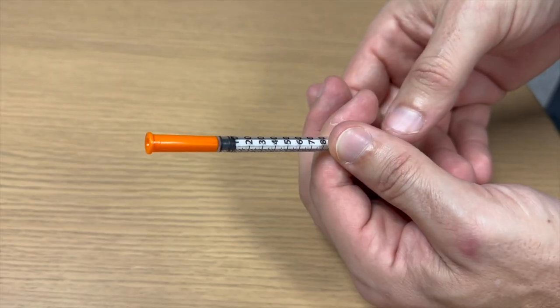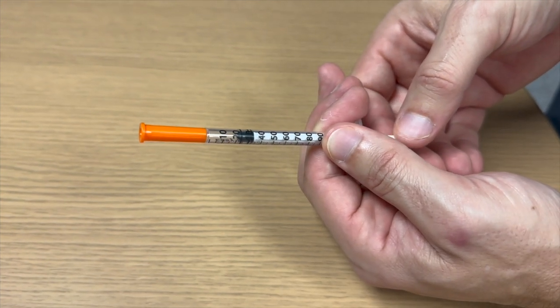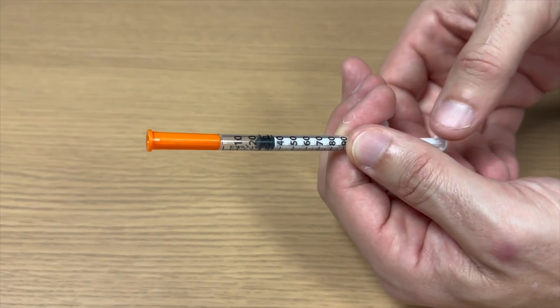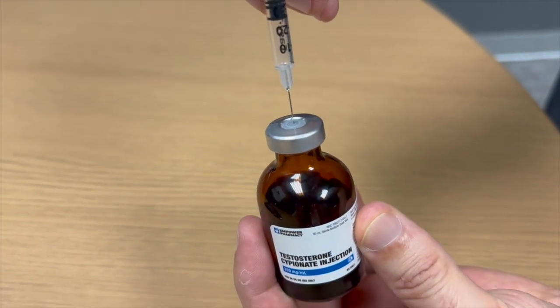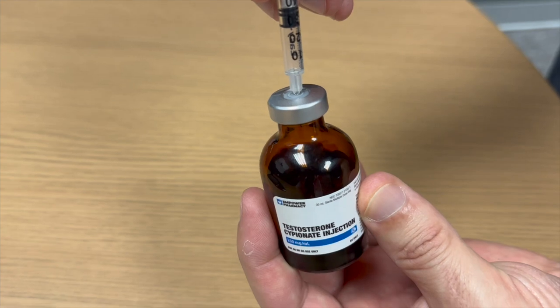Next, draw air into the syringe equal to the dose prescribed. In this case, for demonstration it is 25 units. Insert the needle into the center of the vial stopper and inject the air to pressurize the vial.